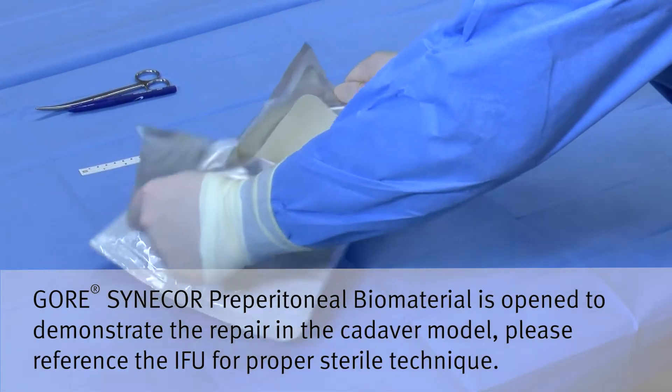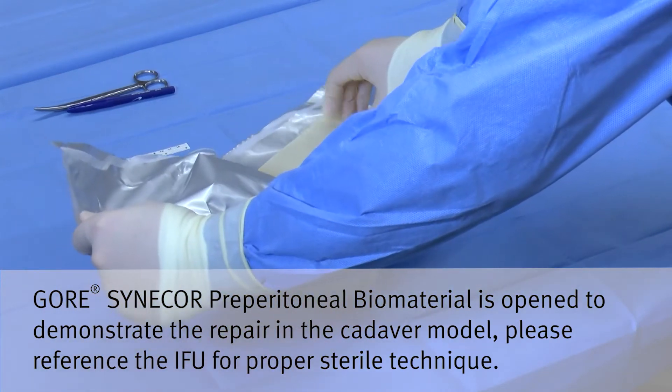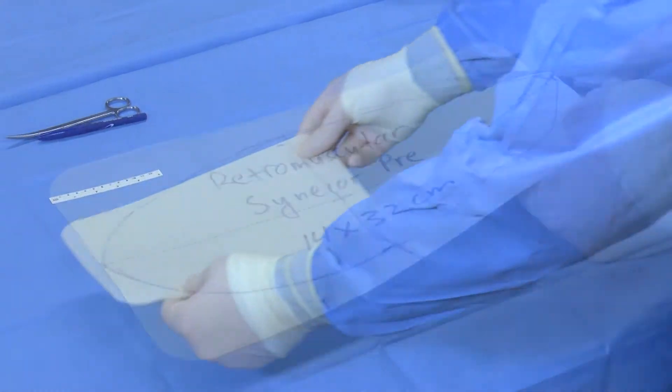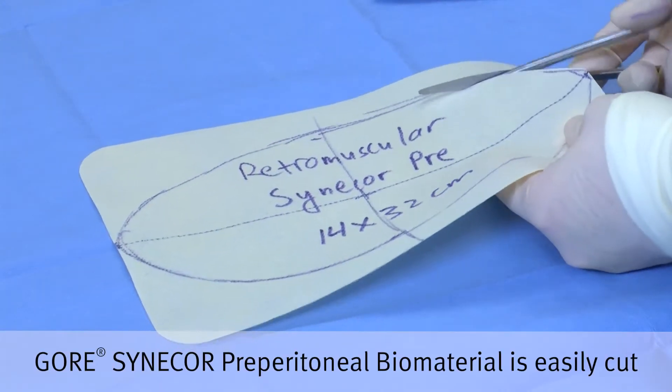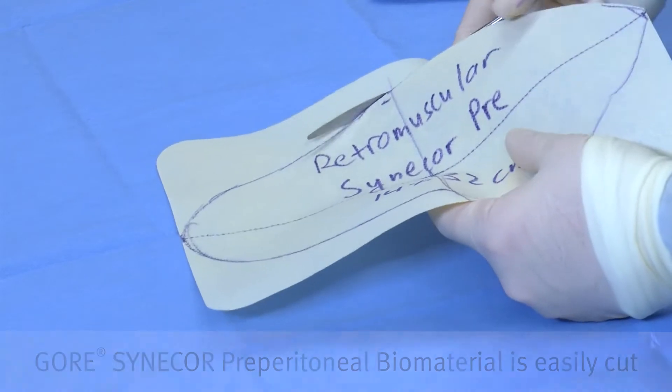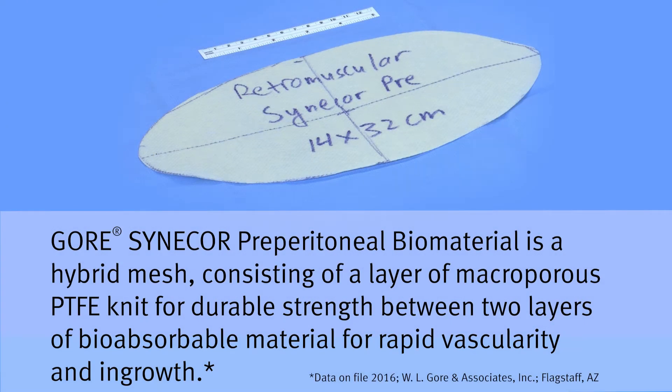A piece of Gore Sinecore preperitoneal biomaterial is opened and designed as a 14 by 32 centimeter piece to reinforce the retromuscular space. Gore Sinecore preperitoneal biomaterial is a hybrid mesh consisting of a layer of macroporous PTFE for durable strength in between layers of bioabsorbable material.